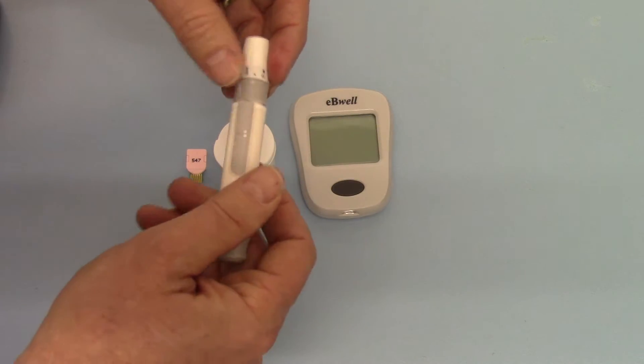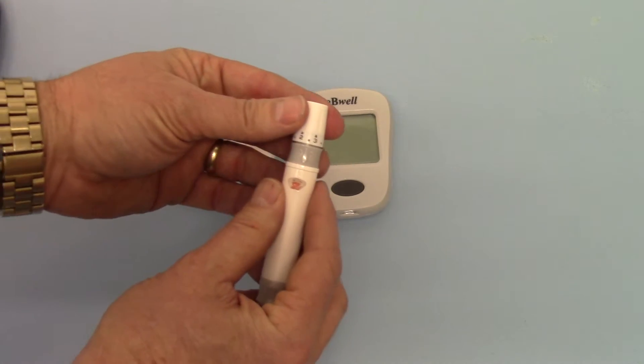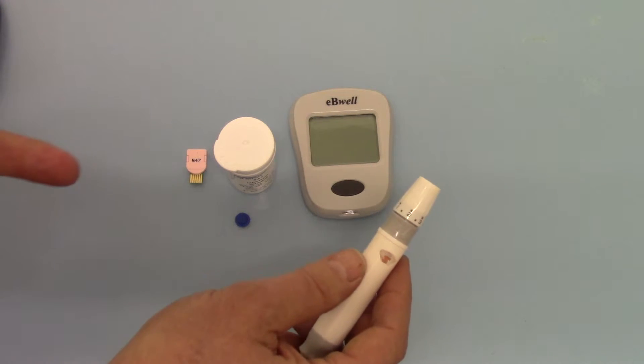We can then put the cover back on. Now I've adjusted this to a lancing depth of 2.3 for demonstration purposes which should hopefully give us a good drop of blood.